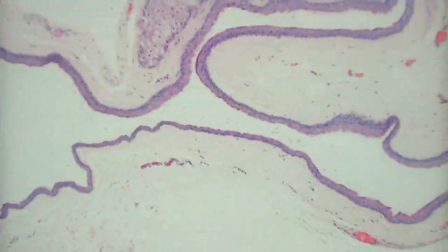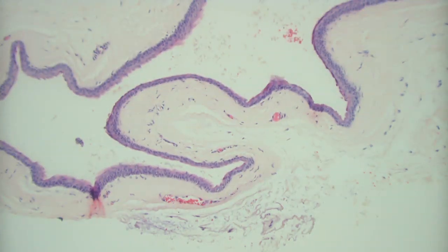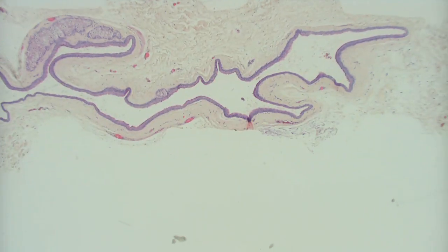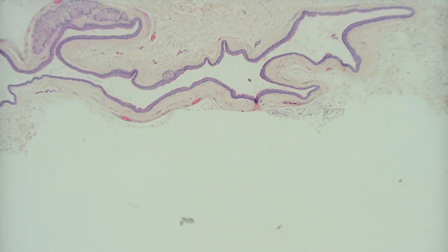Simplex or multiplex. So you get a single solitary steatocystoma, or you get multiple lesions. Now, what's interesting about the multiple lesions? What's the board question about the multiple lesions that they might ask? They might show you this, expect you to diagnose it pretty quickly, and then say something about it being associated with a certain disease or syndrome.